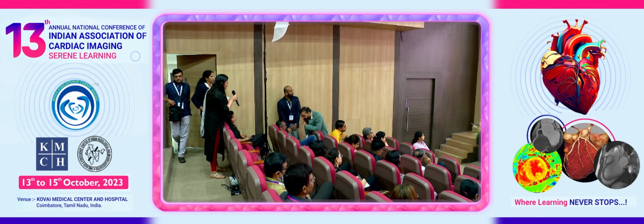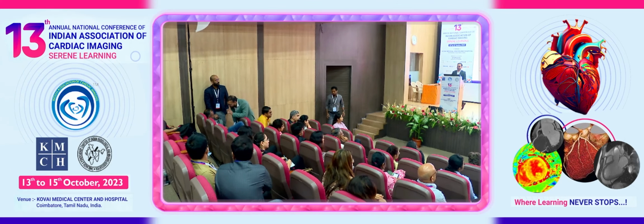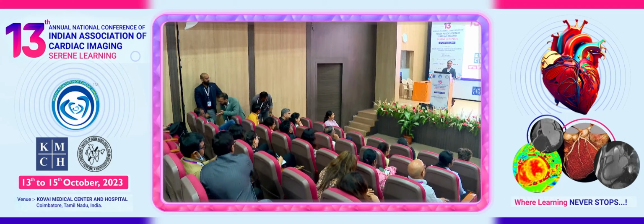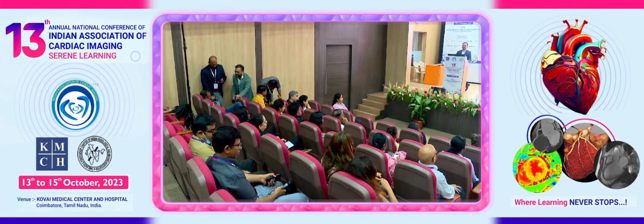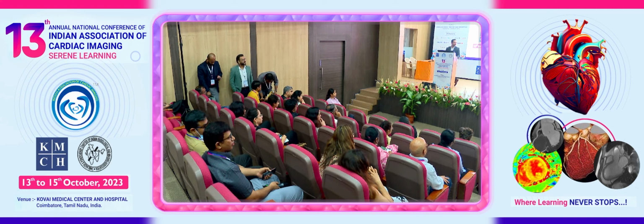Totally. And bringing in the point of techs, it's really important to have your tech really well trained. It's like what Sandeep said, the first 1,000 cases are so important. Like in the first talk, Sandeep spoke about whether you put your ROI in the ascending or the descending aorta. There are times when my tech will not even put an ROI and will start the scan when he needs to, because he wanted to see the pulmonary artery, all the 3. So it just depends on how good your tech is. Get them hands-on, and they must know what they have to do and when, because you can't be on the scan all the time and they need to be trained to that level.